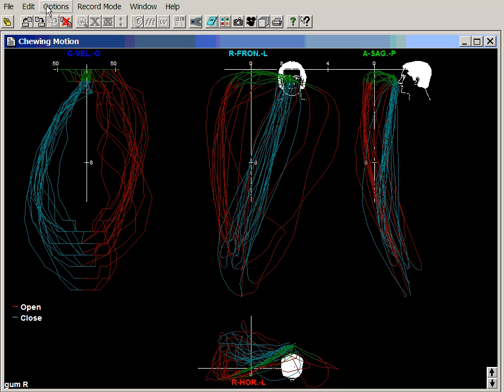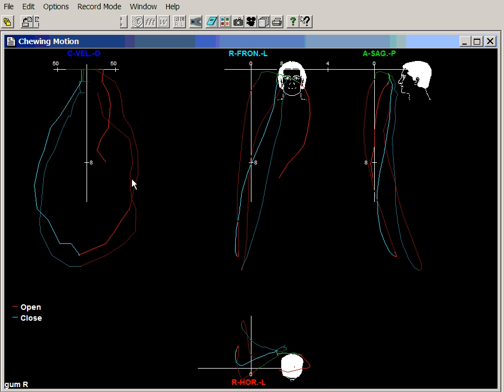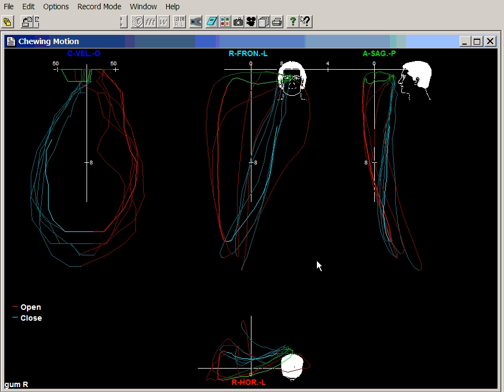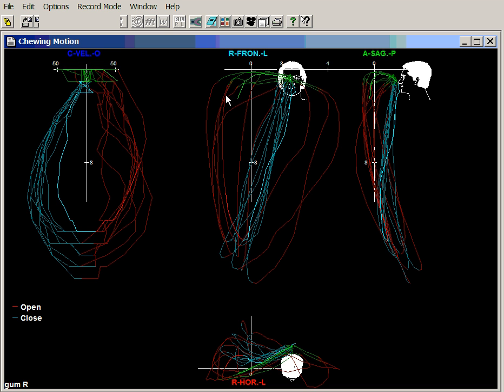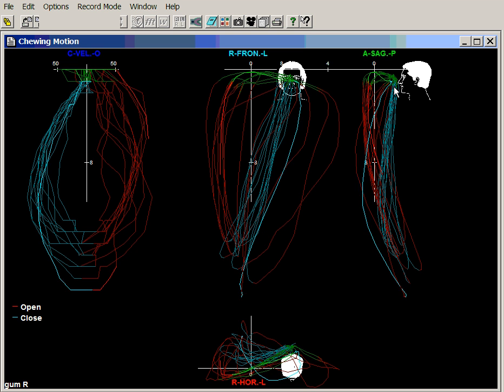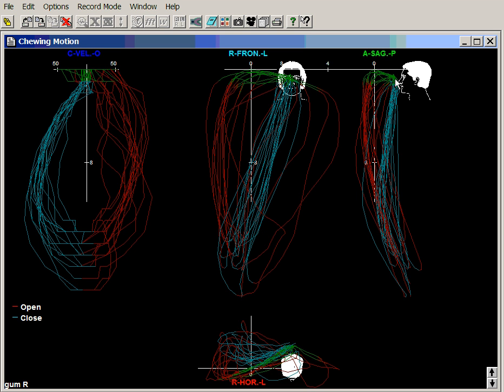If we just redraw that, notice that the opening path sometimes goes to the right, sometimes to the left, and there is very little guidance — that is because the occlusion is so flat. Notice the closing path comes into occlusion, and then there is a great deal of protrusive movement occurring in an upward and forward direction, so there is not any incisal protrusive guidance either.